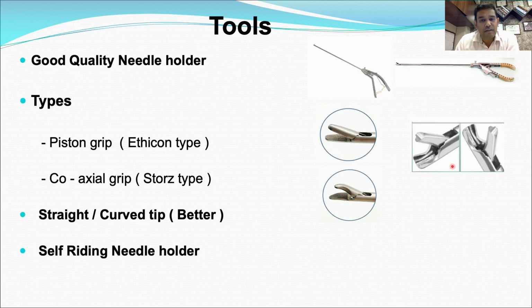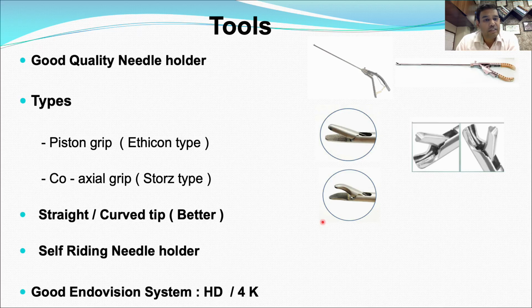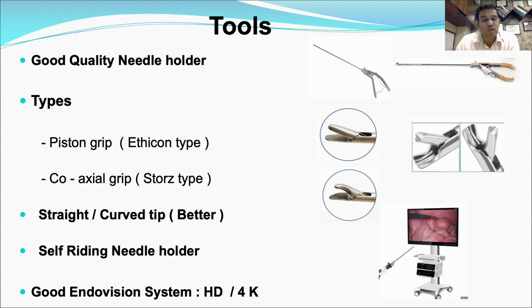The problem with the self-righting needle holder is that you cannot change the angle. So suturing at difficult positions or difficult angles is not possible with the straight self-righting needle holder. Whereas with this type of needle holder, curved or straight tip, you can angulate the needle with respect to your instrument and suture at difficult places. And the last one is a good endovision system. At least HD or 4K is recommended for laparoscopic suturing.